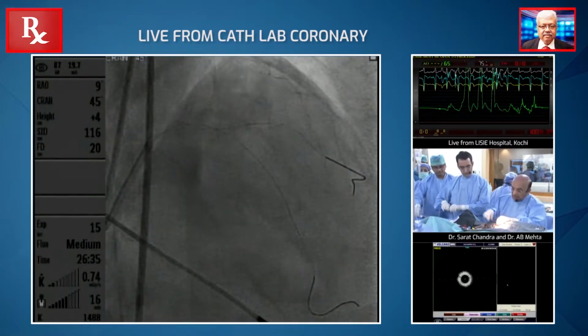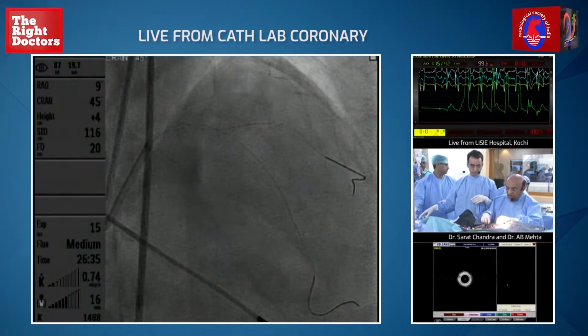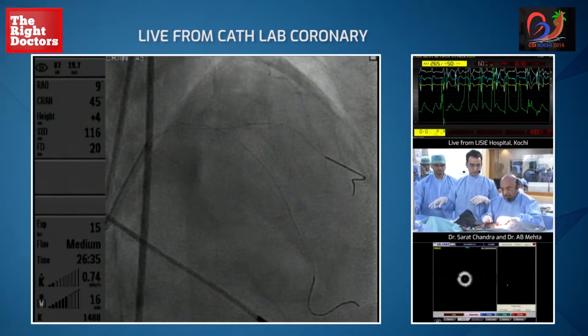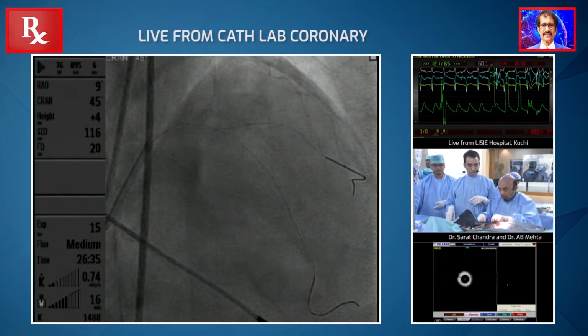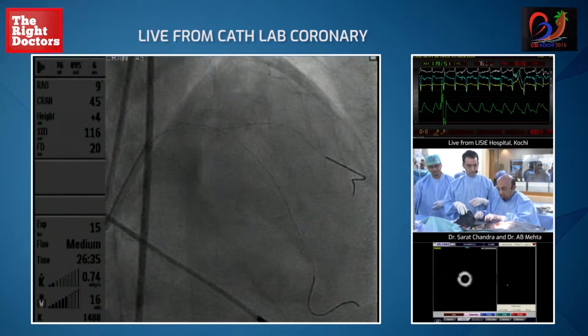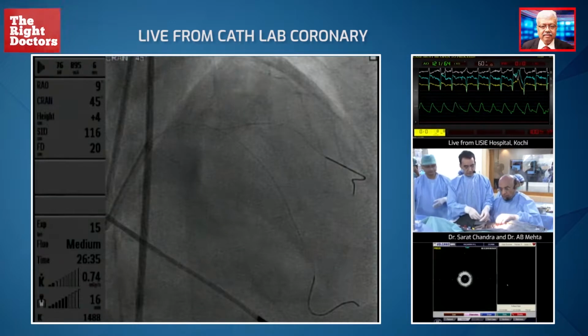Take a stent size balloon. That is 2.5 in the side branch, that is in the side branch stent, and I'll take a regular 3 mm balloon in the main branch. After finishing this, I'll put a stent in the LAD. Yes, I mainly got that.